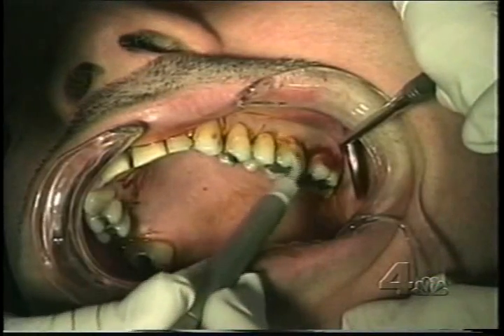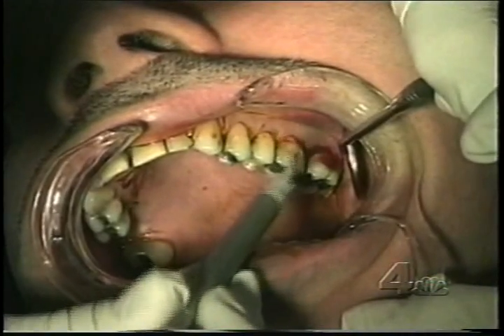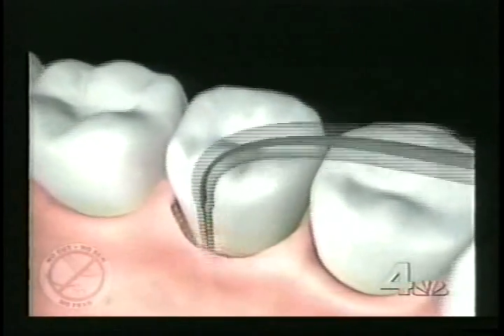It's actually a three-step procedure. First, after local anesthesia, a hair-thin laser fiber is inserted into the infected gum pocket around the tooth root. This kills off the bacteria causing the infection, and alters the plaque and tissue in the pocket so that a piezoelectric probe can literally vibrate the pocket clean.